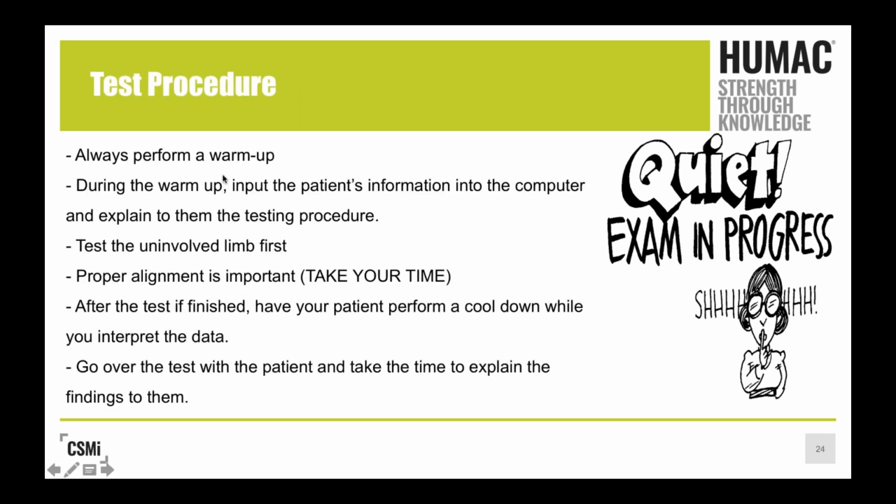All right, your test procedure: always perform a warm-up. We like to go on the bike, the treadmill, the total gym. I like to use air squats and walking lunges with stretching, some RDLs. During the warm-up, put their patient information into the computer, and explain to them the testing procedure as well.